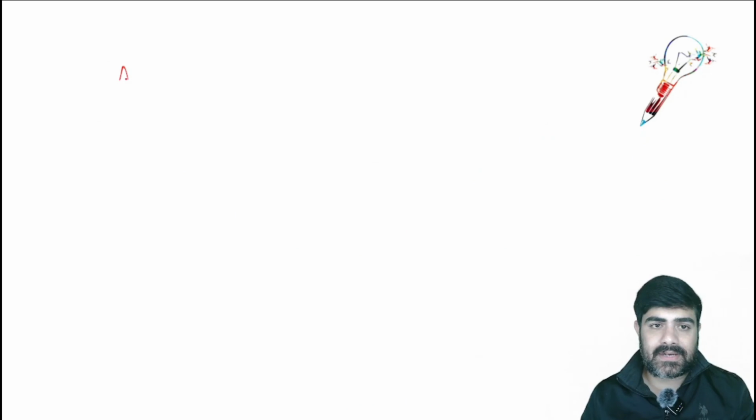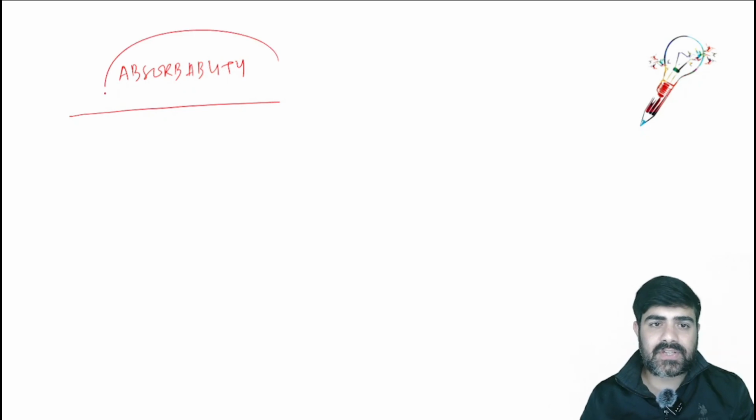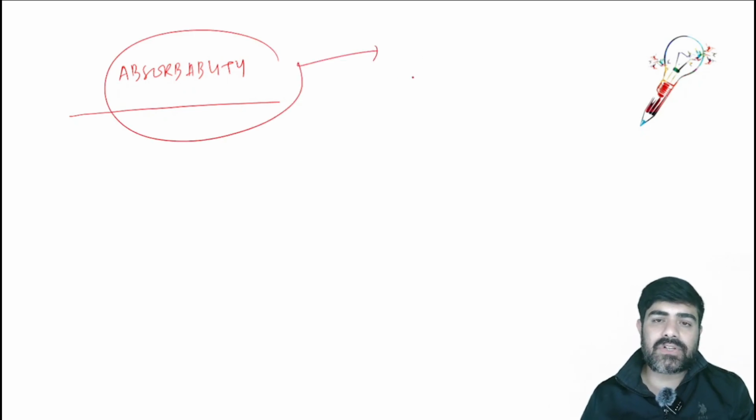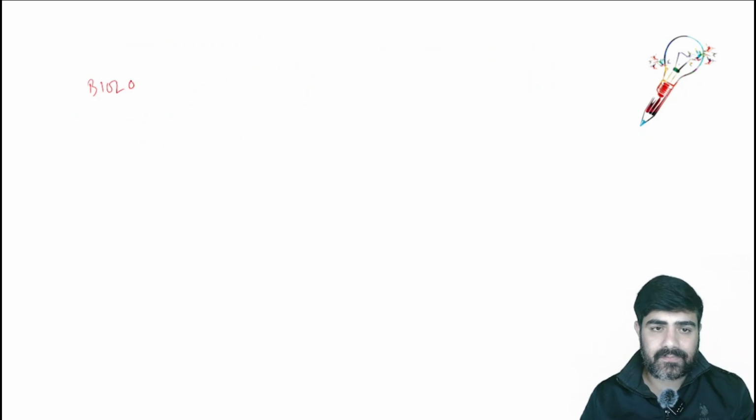Then absorbability. This I'm going to discuss with the individual sutures themselves. Again, they can be non-absorbable and absorbable, we all know. And then biological behavior.